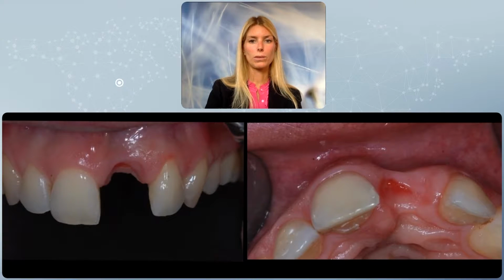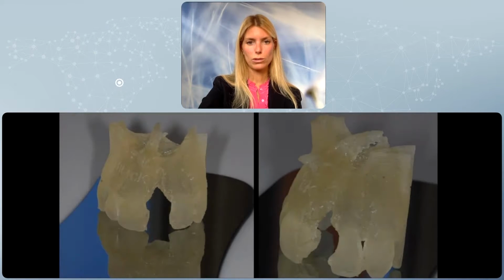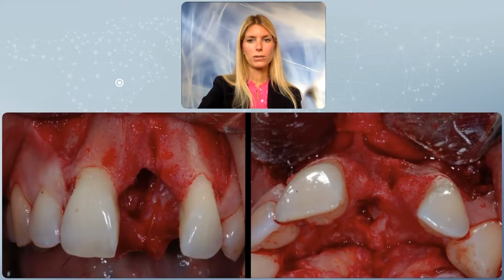Now, as I mentioned, the protocol that I have adopted following all the literature, especially from the Swiss group, is that the moment I extract the central incisor, nothing is performed, to allow only the blood clot in the alveolar socket and the soft tissue closure of the socket by itself. This will naturally heal by only 6 weeks, after which we are ready to intervene. And we know we are faced with a vertical and a horizontal defect because we have seen during the extraction what had gone away. So we're not surprised at all, and we plan with our 3D models in a very predictable way. We plan our 3D reconstruction.